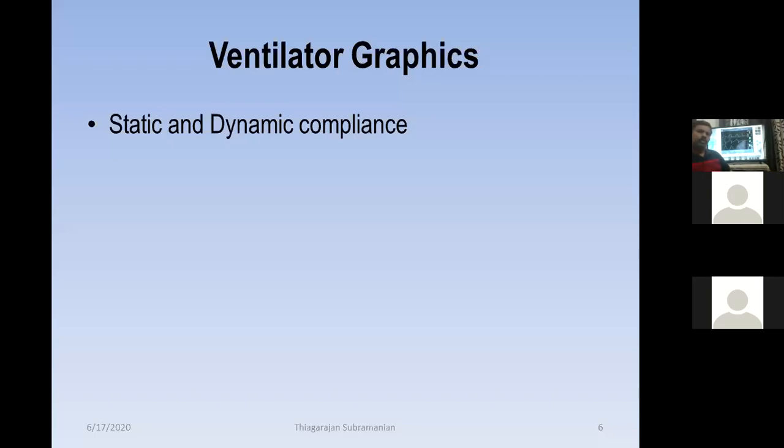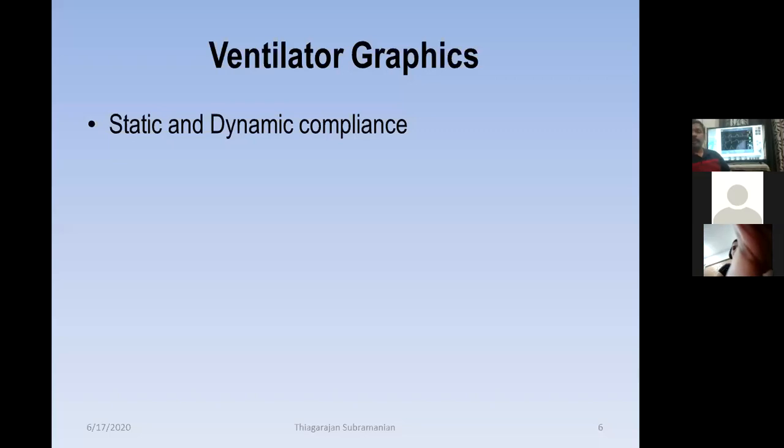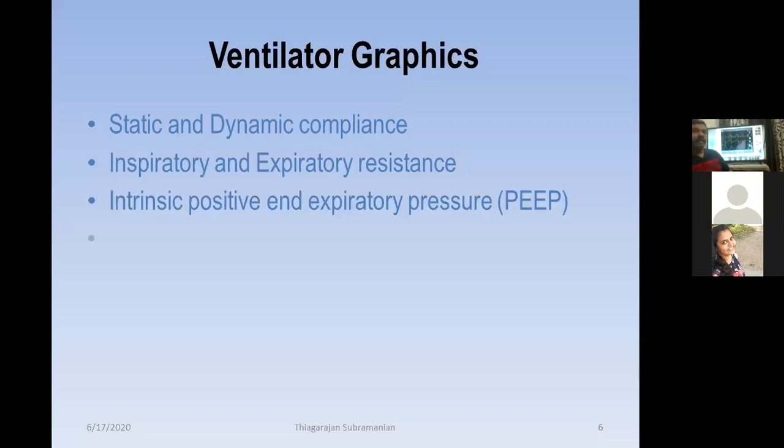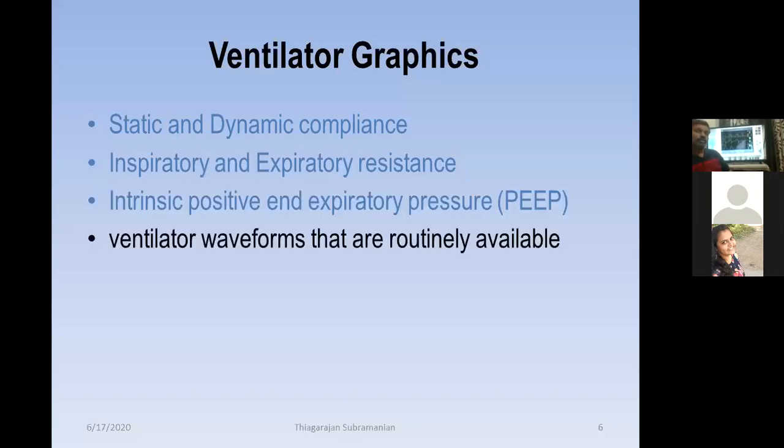So I just want to talk about why we should use ventilator graphics. First, they did it to find out the static and dynamic compliance of the lungs, and to check the inspiratory and expiratory resistance, as well as intrinsic positive end-expiratory pressure. That is another important thing to remember. And ventilator waveforms which are used routinely can be analyzed. That was the main objective of that particular questionnaire.